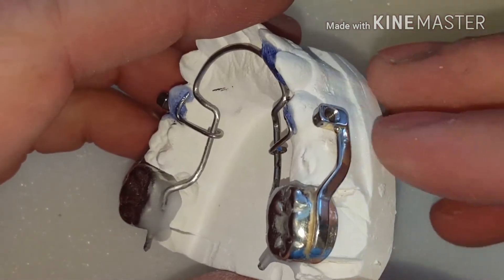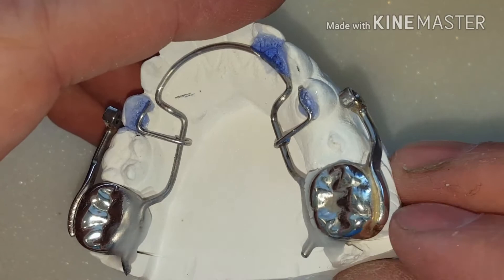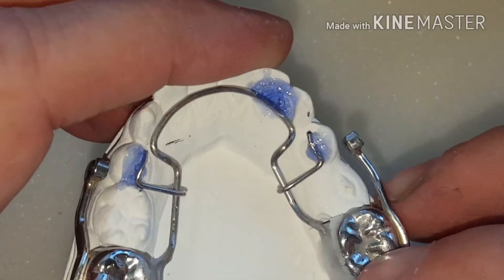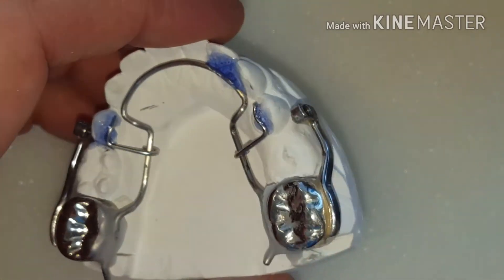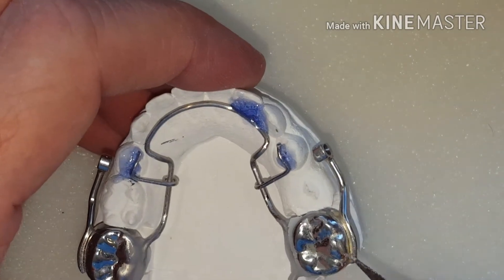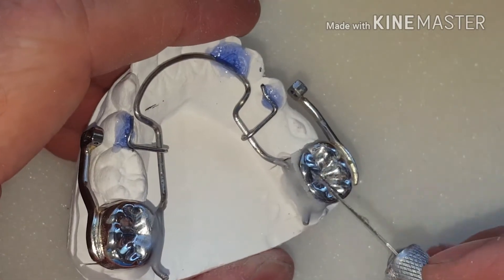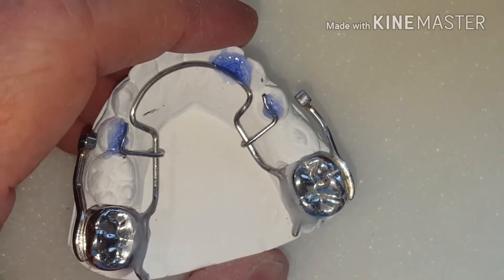This is a Herbst appliance that has stainless steel crowns that are laser welded. I can go ahead and solder this without worrying too much about hurting the crown, but by adding so much heat, this laser welded part right here is going to become a little bit weaker, so I'm going to protect it.